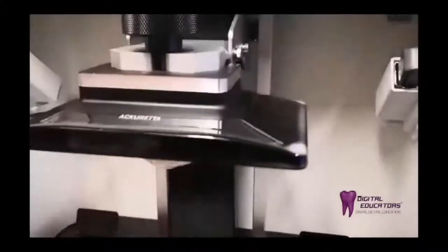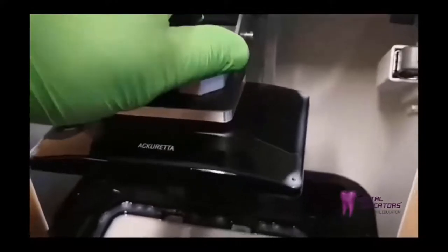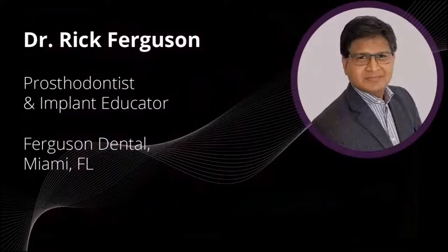Now that the print is complete, we can remove the build platform by unscrewing the build platform screw and inspecting the print to make sure that everything is there. We're ready now for post-processing.